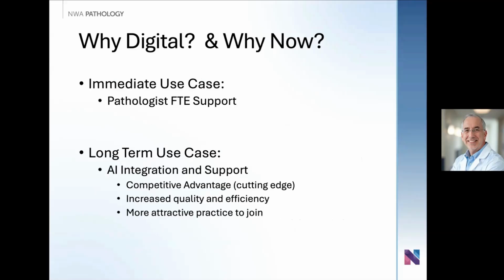The question many of you are probably here to have answered is, why digital and why now? For us as an organization, the decision-making process was really two-pronged. The immediate use case was access to additional pathologist support through remote digital sign-out. Our long-term use case involves AI integration and support.